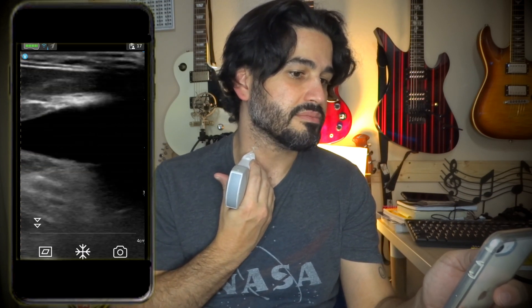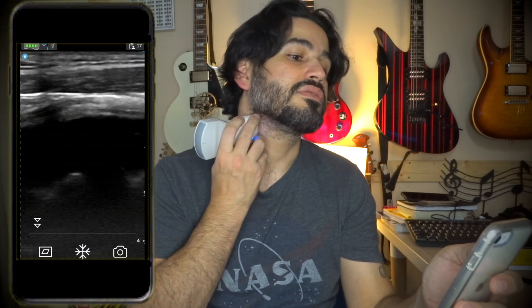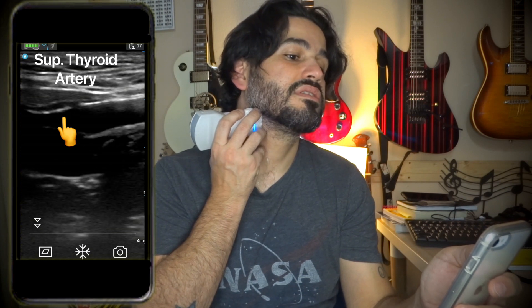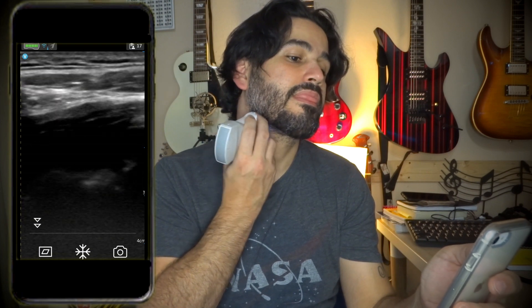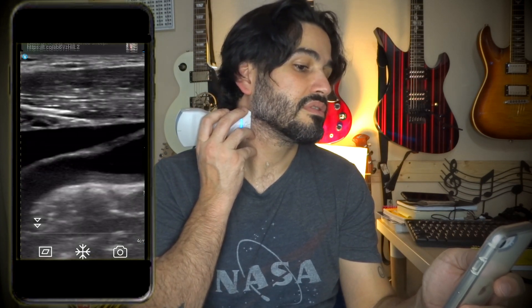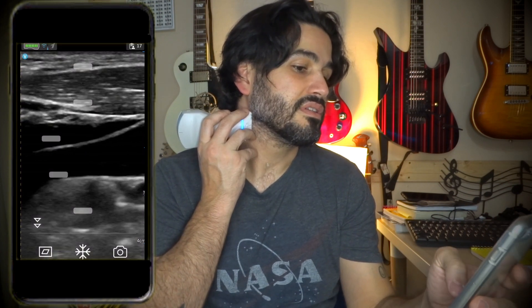More laterally, there's my jugular. Going up you should be able to see the bifurcation — that's the bulb right there. If I angle towards the face, that's the ECA and you can see the little branches. If I go away from the face, that's the ICA. Coming from a posterior approach you can see it right there.